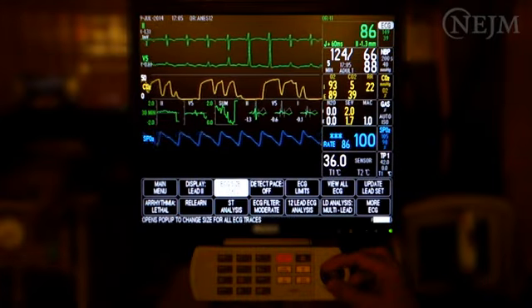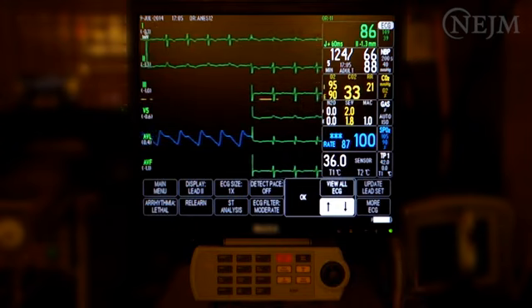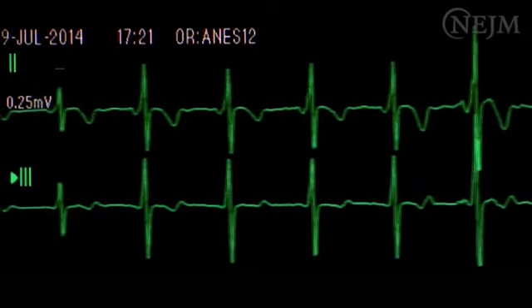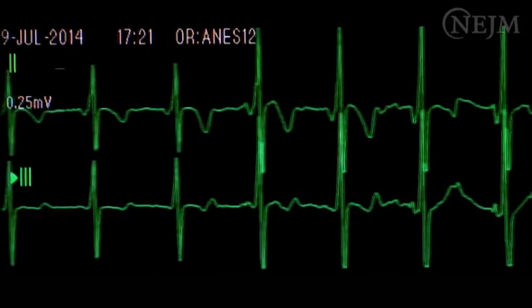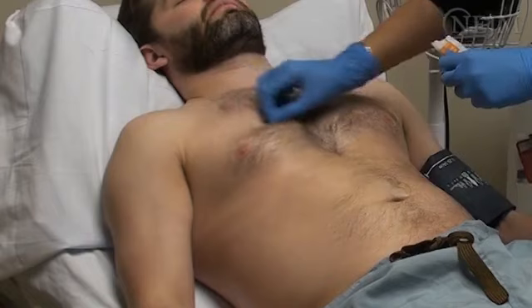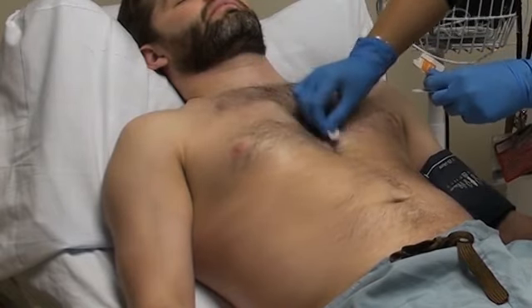Most ECG monitors display 1 or 2 waveforms at the top of the screen. If desired, additional waveforms can be displayed. A menu on the monitor may allow modification of the amplitude of the graph to optimize viewing of waveforms. In addition to the ECG equipment, you may need alcohol wipes and a razor.